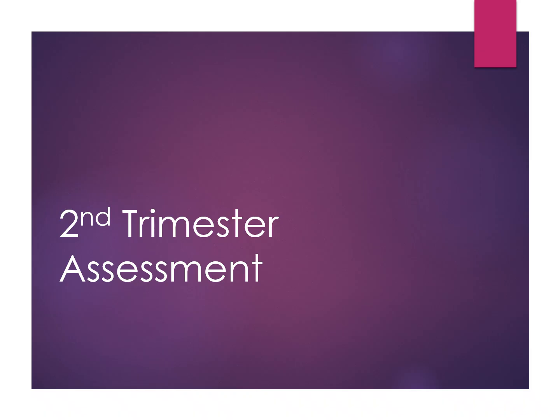We are moving into second trimester assessment. The second trimester runs from week 13 to week 27 and 6 days. So that is the gestational age that we are going to be working in, and we have all of our organs. Organogenesis has completed, and everything is just kind of in the growing phase now. So we're going to measure and look at everything from top to toe of the baby. I have some really good images that we can follow along with, and just see what a normal second trimester assessment would look like.